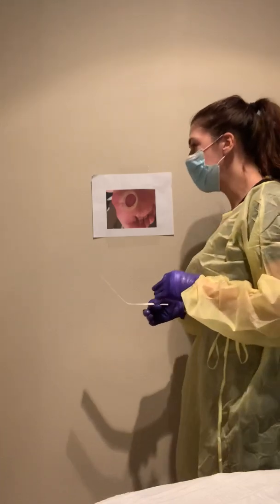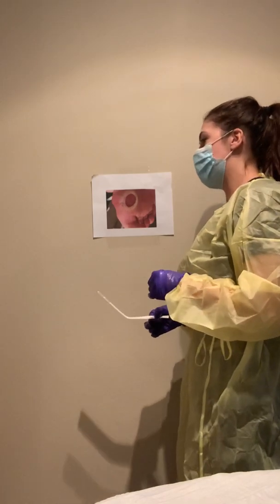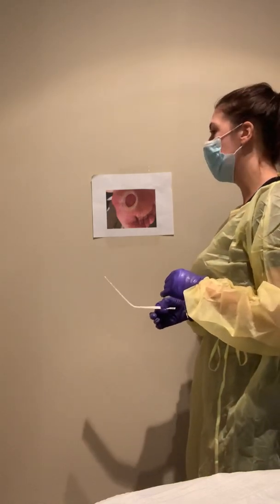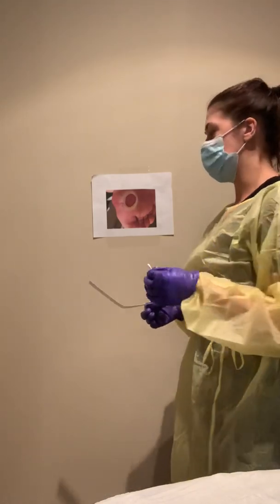Now my etiology for this wound, I would say, is peripheral neuropathy. Based off of the HPI, the patient was unable to feel the 5.07 monofilament on 5 of the 9 locations. And the interpretation of this is loss of protective sensation.